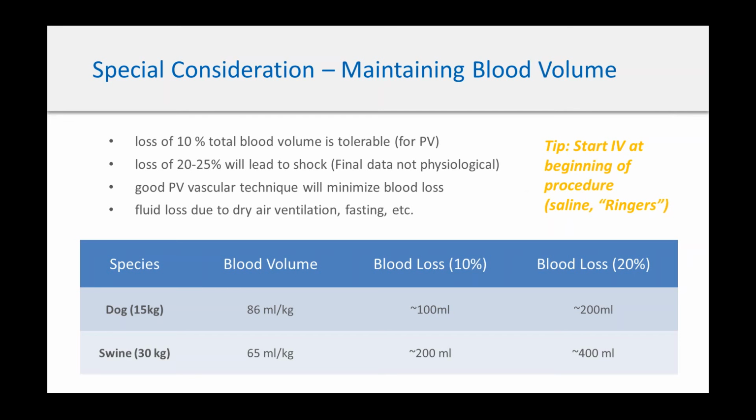We find that saline works well enough, and we're pretty careful about it, but we really watch our animals, and if they're sick, they might be even further dehydrated, and so you really want to try to standardize those things between animals to get good pressure volume data.